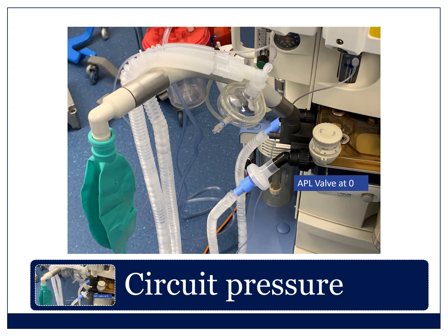It's testing there's not a massive leak. It's testing that there's gas coming out of your machine. It's testing you know how to use an APL valve, and it's testing that you can ventilate the patient. So that little test, just before I put it on a patient's face, I check that I can generate pressure, I open the APL valve, and I put it on the patient's face. And if you do that, there are so many things you're testing with that little maneuver. You've done more than half of an anesthetic machine check just by what I've told you so far.